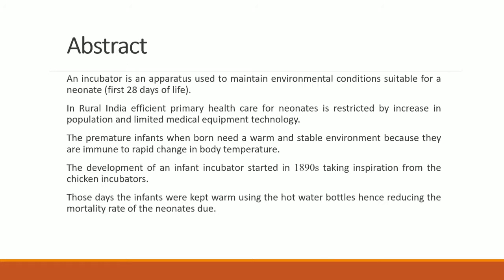An incubator is an apparatus used to maintain an environmental condition suitable for neonates. Neonates means the first 28 days of life. The infant incubator is used to provide a warm environment for infants to keep their body temperature in the normal healthy range. It is difficult for the government to allocate incubators to each and every hospital in the rural areas because of the high cost and transportability. So we are developing an incubator which will help people in the rural areas get a facility at an affordable price, with no transportability issues too.